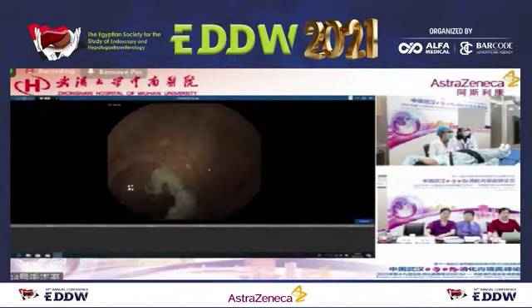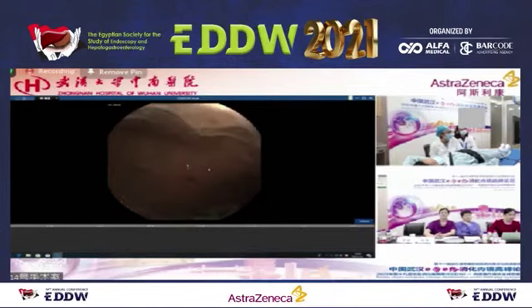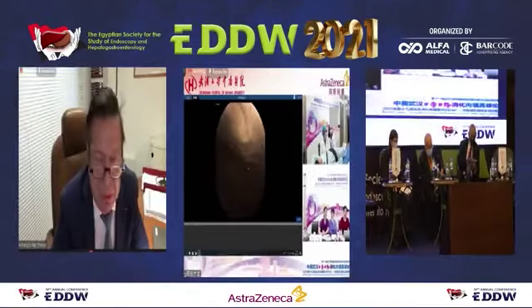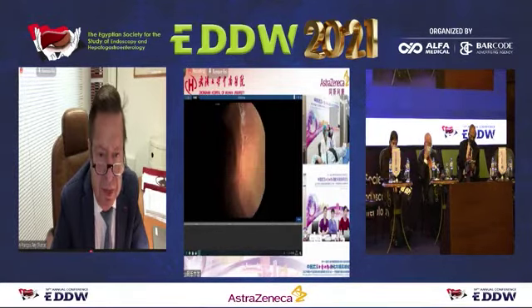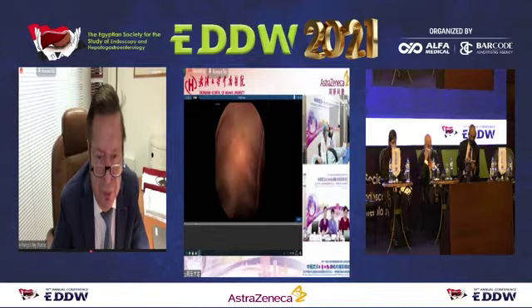Can you say that again? I'm sorry. The diagnostic accuracy of this gastric guided capsule is about the same as routine gastroscopy.